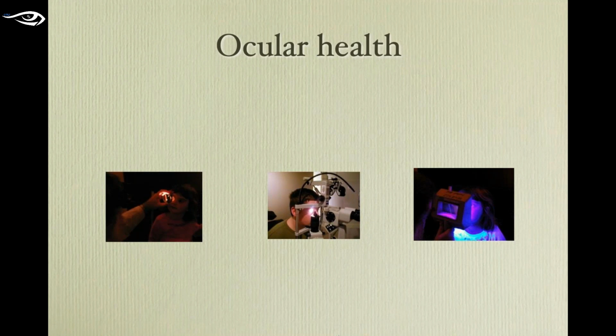Again, I fully recognize that many of you are not in a position where you can use drops. If you can't, do the best you can, but you are in effect only kidding yourself. You're only seeing a minute percentage of the retina through an undilated pupil. In a baby, you're not getting much of anything. You really can't do a direct ophthalmoscopy of many babies. It's just not going to happen.